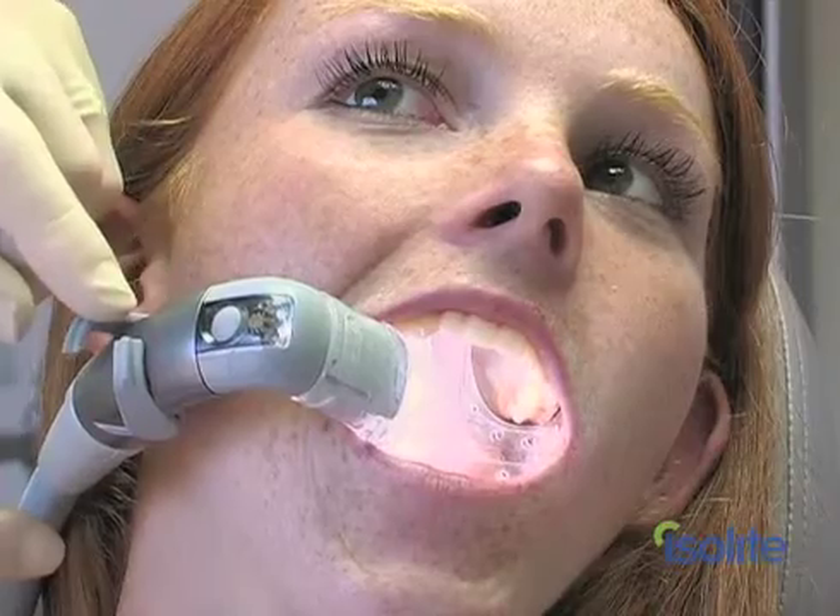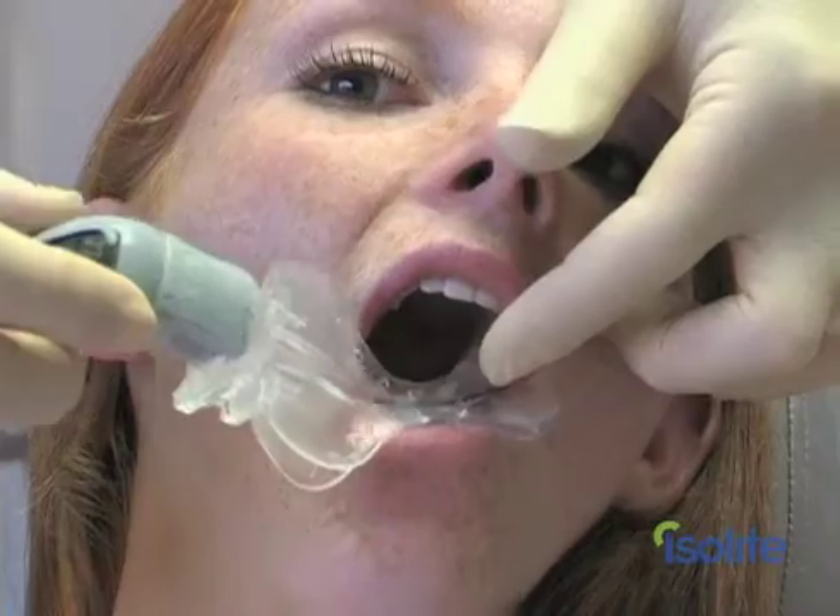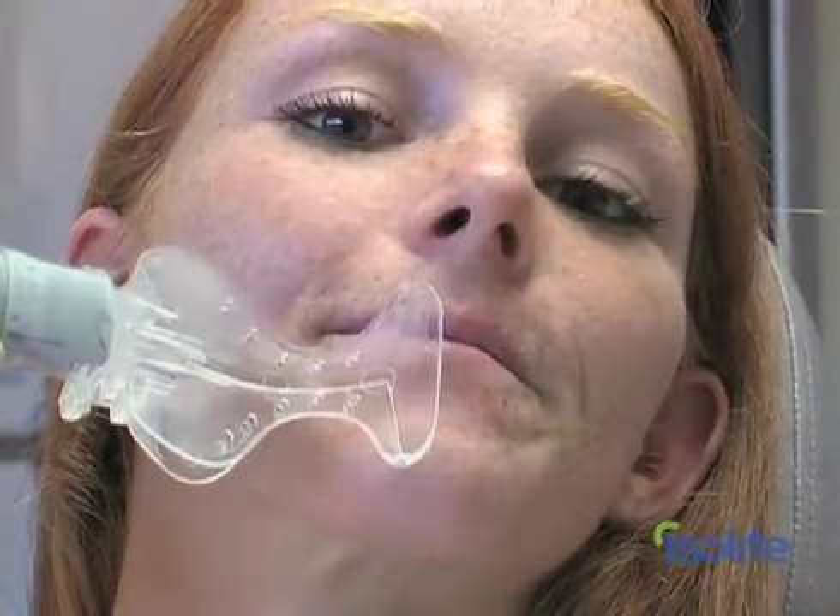By converging the powers of light and suction and retraction, the Isolite Dryfield Illuminator delivers unprecedented visibility and access to the working field. It's safe, and it's incredibly comfortable for the patient. In short, it's a leap forward in dental isolation.